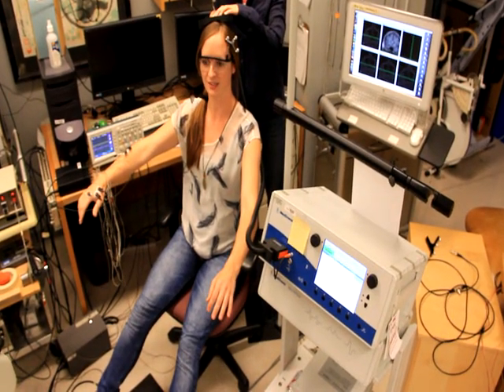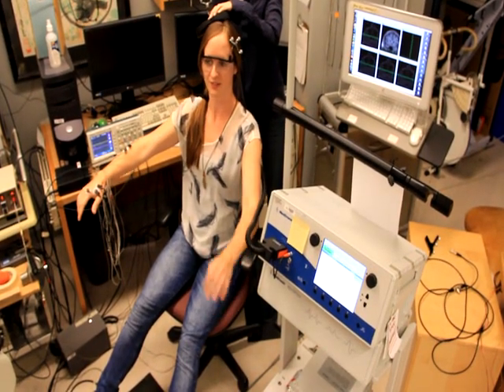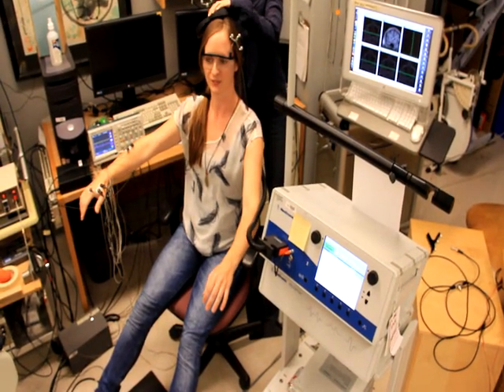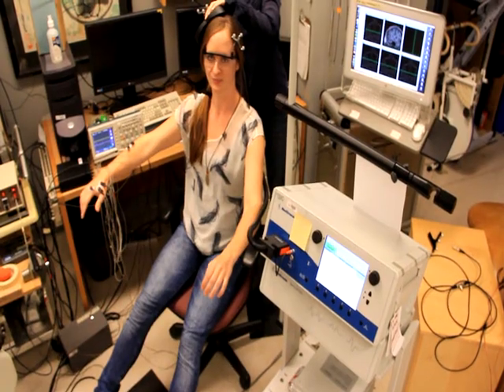We've switched hemispheres. More leg on the left side, left shoulder, left elbow, and left hand.